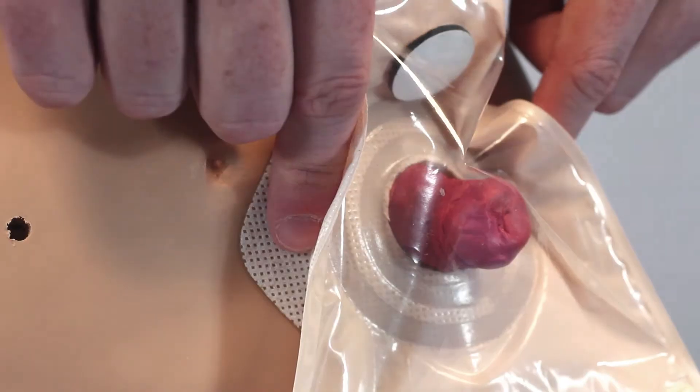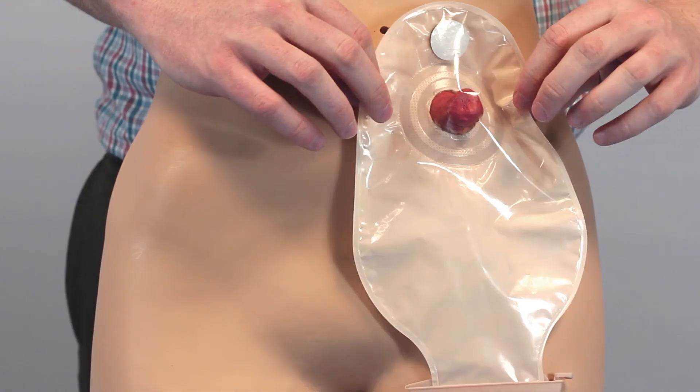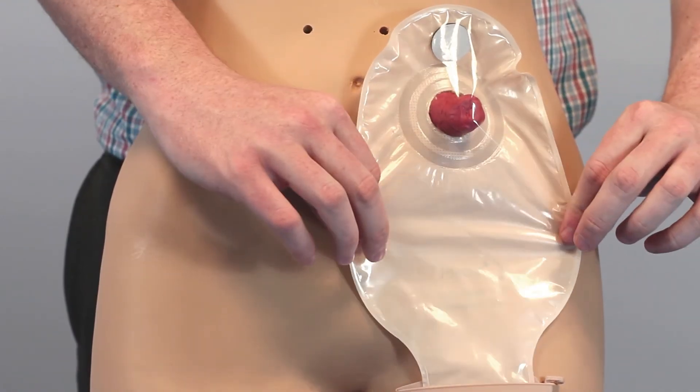Then the outer edges of the barrier can be sealed. Smooth out the bag and keep its slim profile. And that's all there is to it.